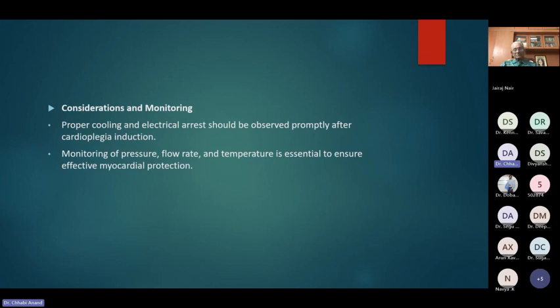Consideration and monitoring. Proper cooling and electrical arrest should be observed promptly after cardioplegia induction. Monitoring of pressure, flow rate, and temperature is essential to ensure effective myocardial protection.